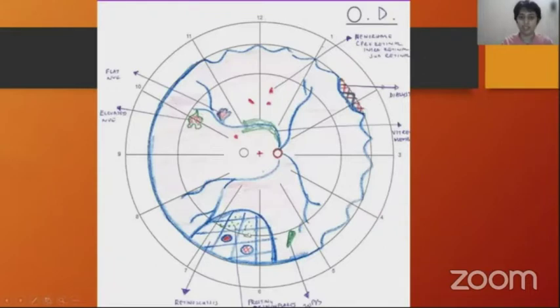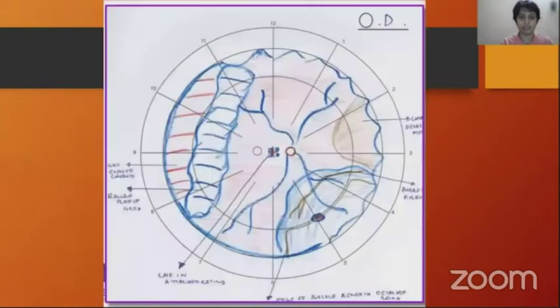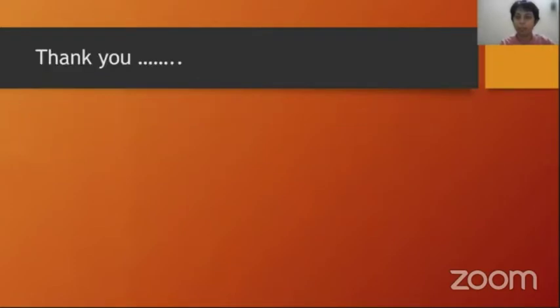So retinoschisis. GRT, where the rolled out flap has a cross blue and the exposed choroid cross red. Macula in attached retina, but there are cysts that is given a blue color. So this idea on documentation, which just needs practice. And thank you for your patience.